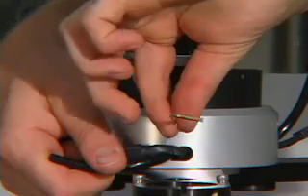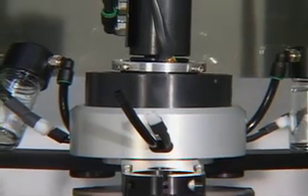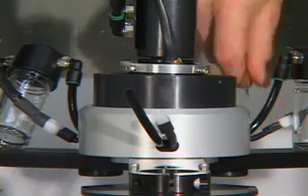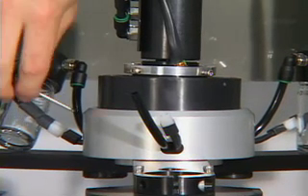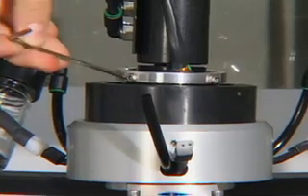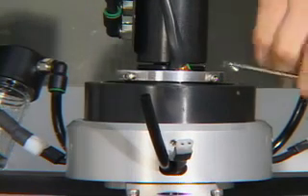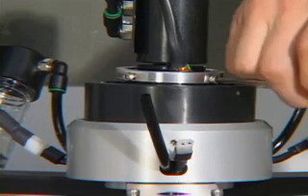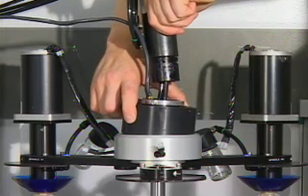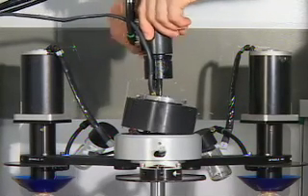Loosen the three set screws on spindle motor hub. Loosen the two Allen bolts on lock collar. Pull rotary union out of brush block and remove from assembly. If you are replacing rotary union only, leave brush block cords in the hub assembly.